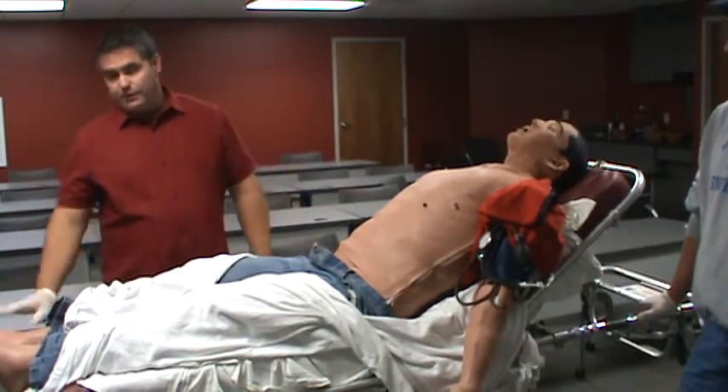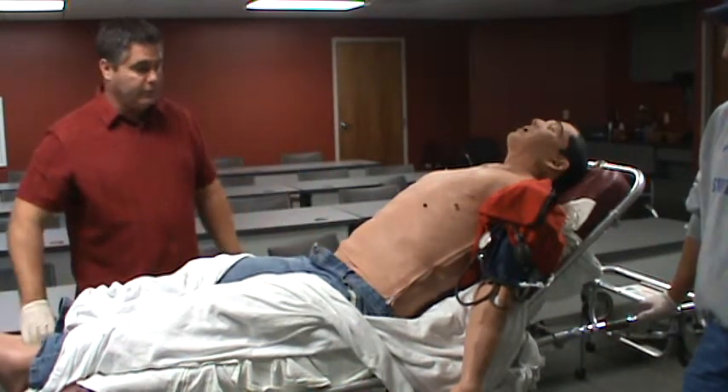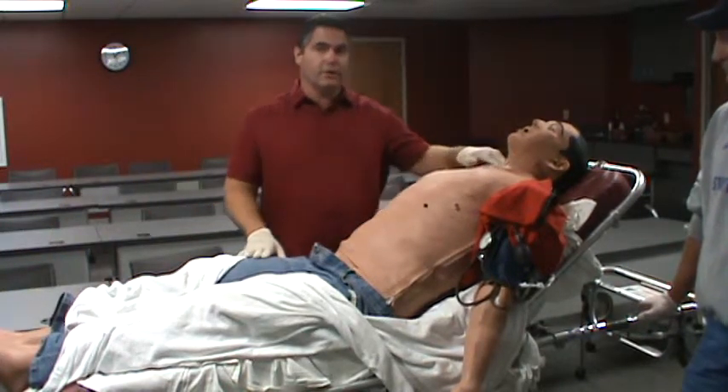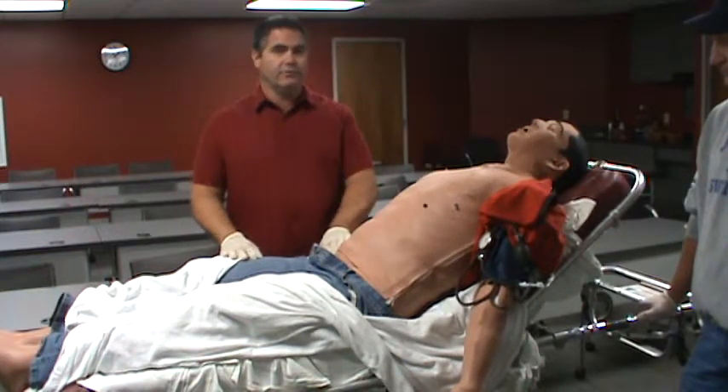He does have pedal pulses and posterior tibial pulses as well. Prior to going through your simulation, I recommend that you feel all those pulses. If you have problems locating the carotid pulse, make sure you know where the femoral is — it's pretty prominent and you'll be able to feel that.